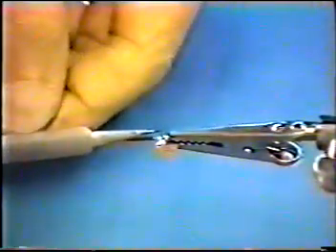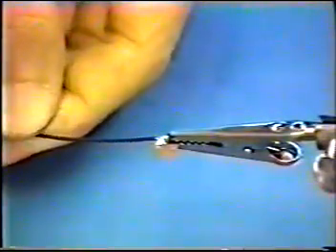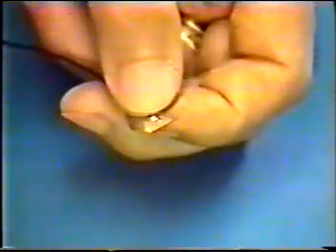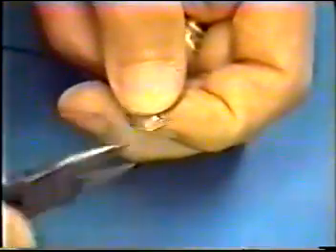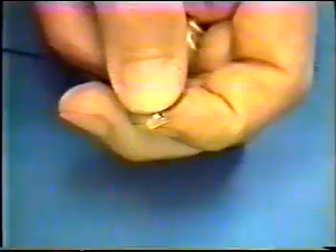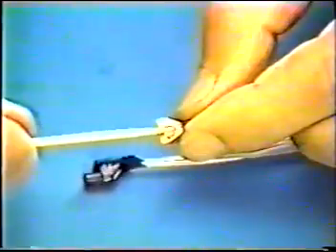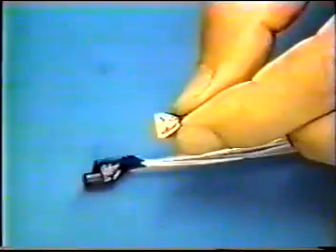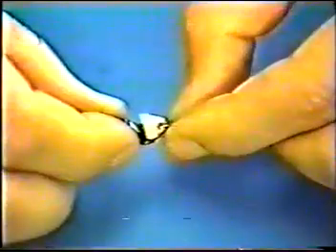Solder a lead wire on the copper foil to be used for protection against electrosurgical noise. Fold the foil to the size of CHA. Apply 5 minutes epoxy on the foil and CHA and hold it with a clip until epoxy cures.